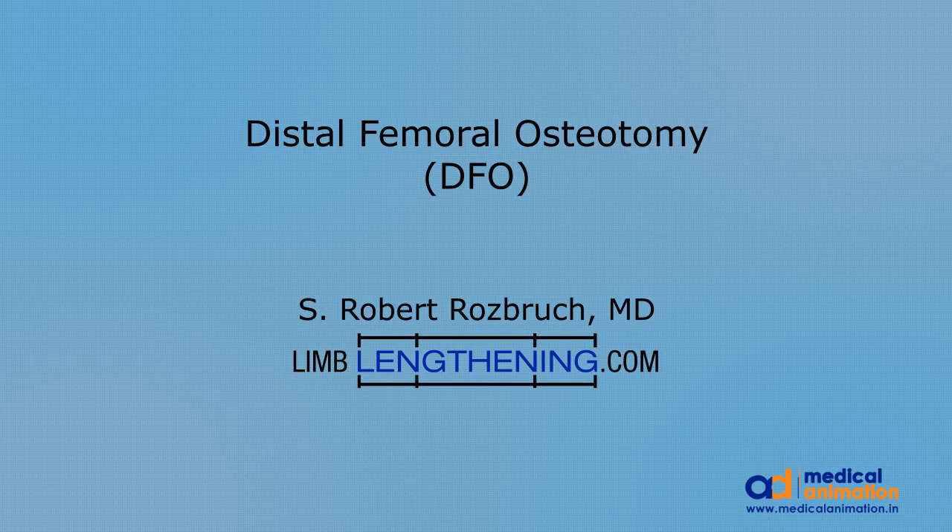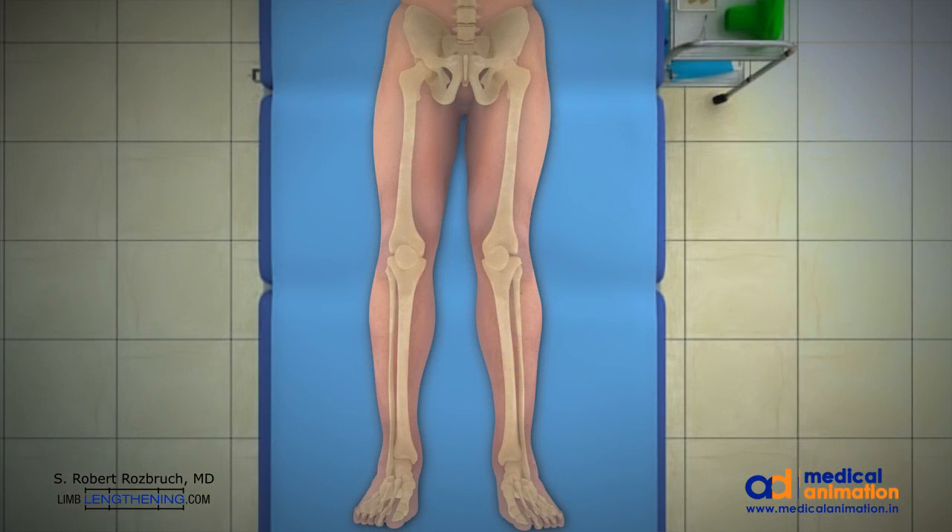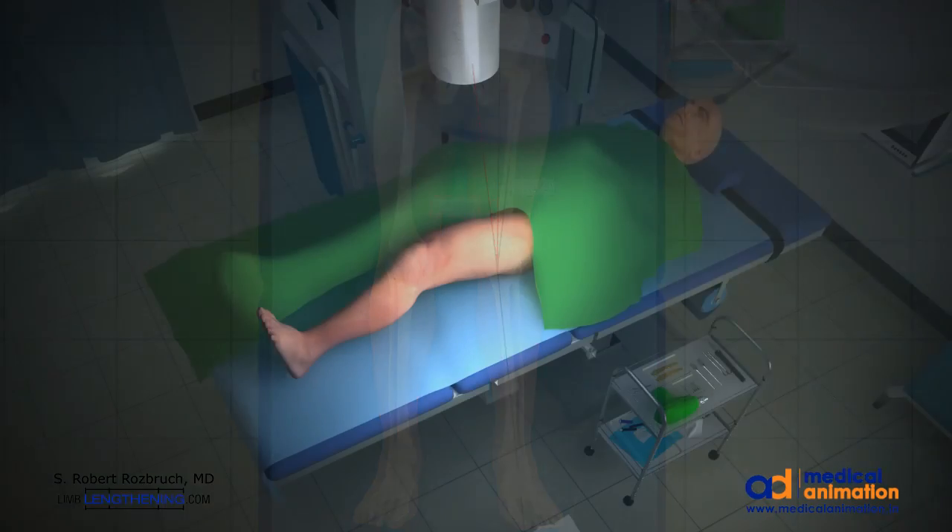This is Dr. Rob Rosbrook doing an animation of distal femoral osteotomy. This patient has a valgus or knock-knee deformity, and mechanical axis planning shows there's 12 degrees of deformity. This allows us to plan the size of the open wedge.